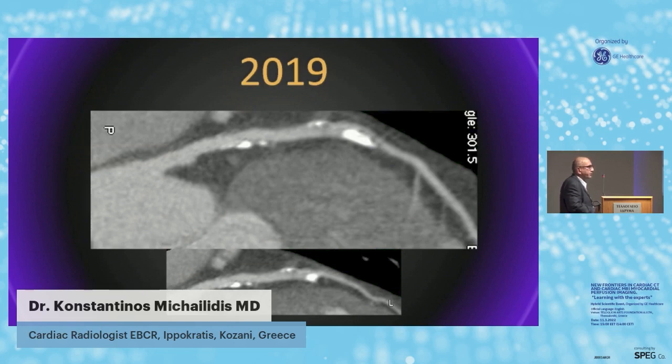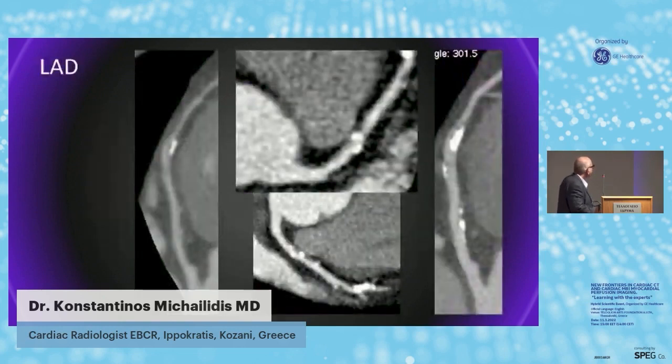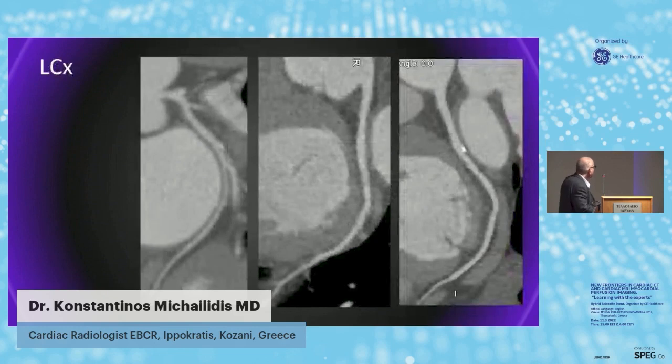These plaques do not have potential to harm the lumen, these nice oval-shaped plaques. Again, you can see here the LAD, how it changed in the years. Here has a lot of contrast. So again, this is 2008, 2013, 2020.